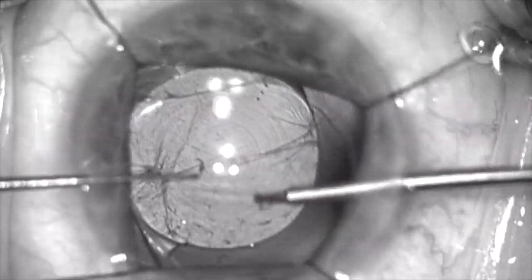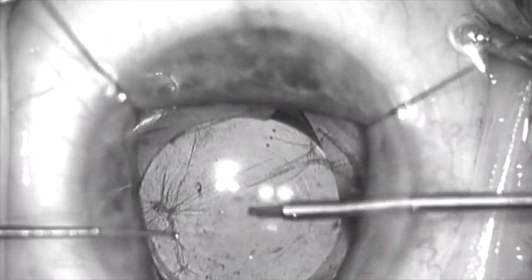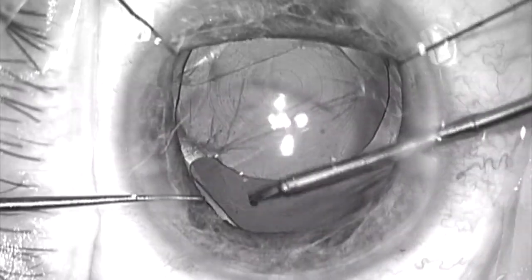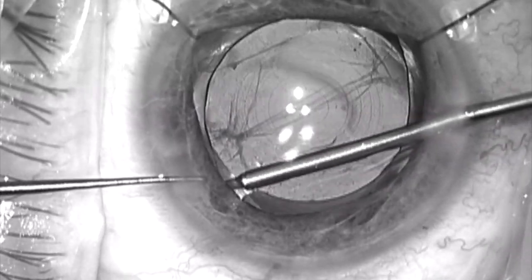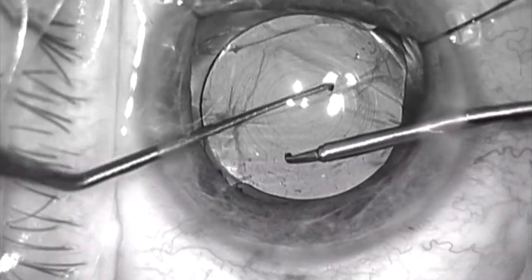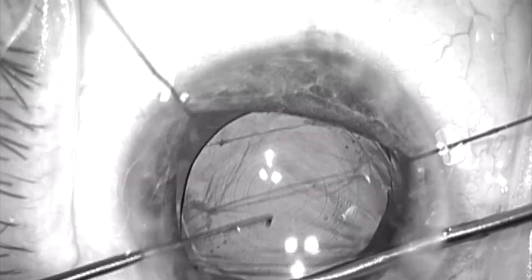I'm going to push this haptic-optic junction into the capsular bag fornix. And I can feel the lens seating a little bit better within the capsular bag fornix. I still feel like this haptic may not be completely in the capsular bag fornix, so I'm going to rotate it into the capsular bag fornix completely at this point, which means the lens ends up a little bit further away from the intended visual axis than I would like. Here you can see me rotating the lens into the capsular bag.